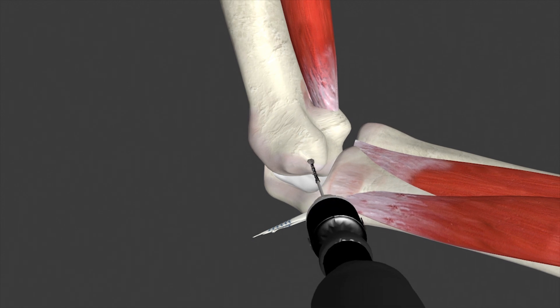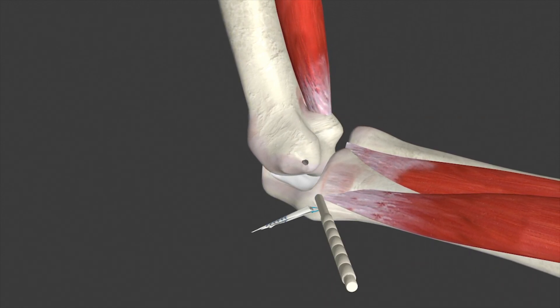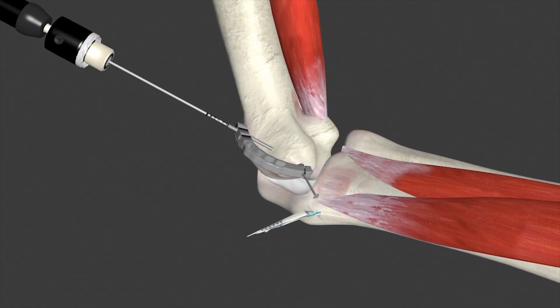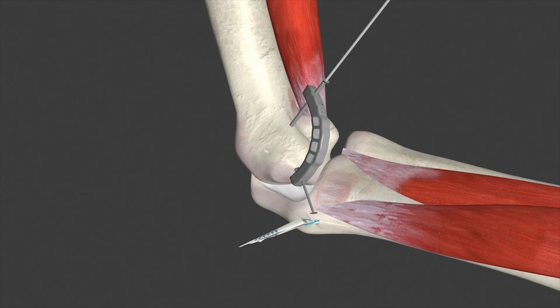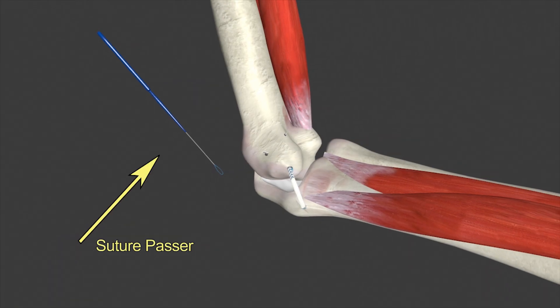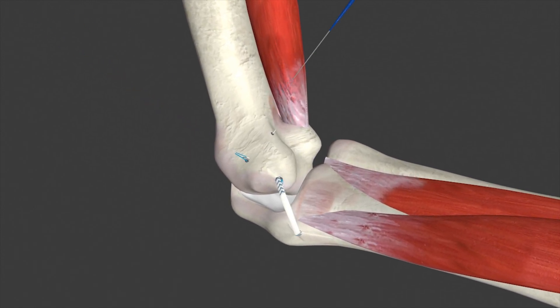Now, the surgeon will create a socket in the humerus, again using a guide pin and reamer as you see here. Now, we have to make sure we have a way to anchor the grafts, so it's necessary to make two small drill holes. A tool called a suture passer is used to move the graft into the socket after it goes through the drill holes.